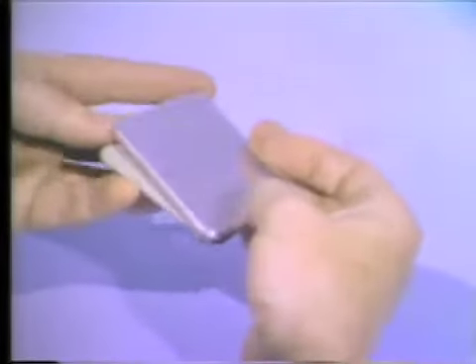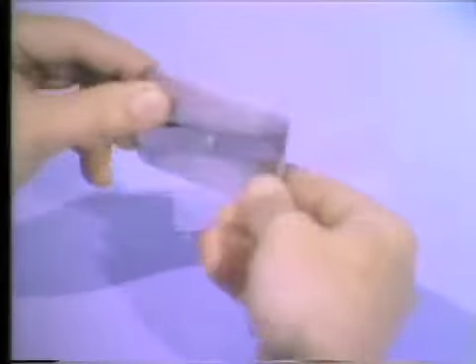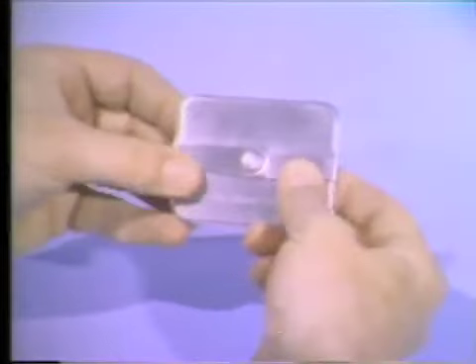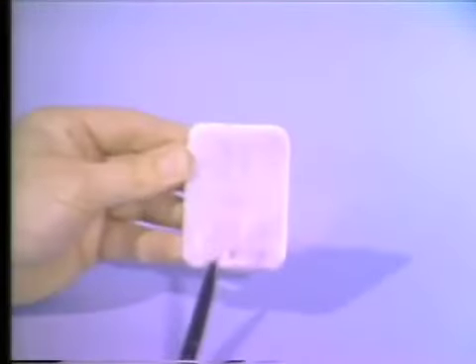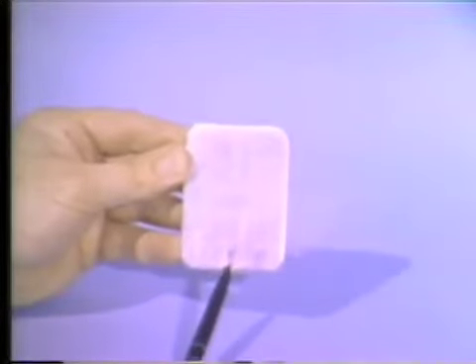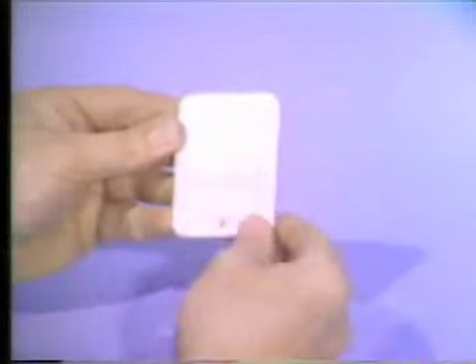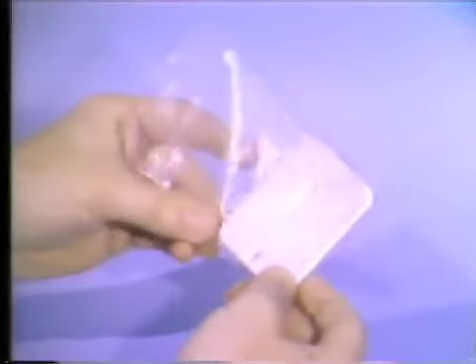The film is placed in an intraoral cassette of lightweight metal. After careful closure, the compression spring on the back is locked in place. Note that there is a letter R on the front surface of the cassette to identify the right side of the exposed film. Since we cannot sterilize this device, it is placed into a small plastic envelope each time it is used.